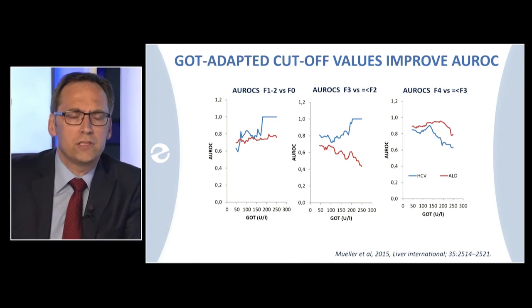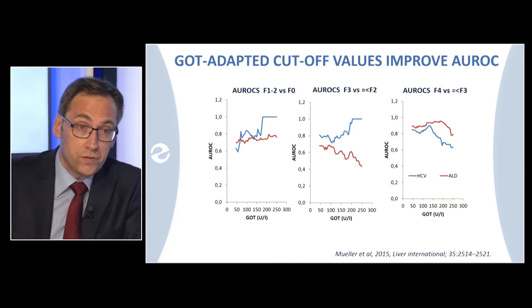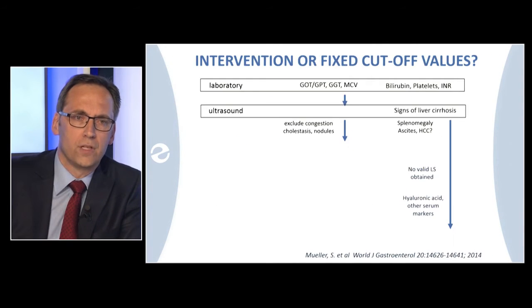I did not mention that we could also show in the study that, in fact, it improved fibrosis stage assessment. And what I show you here is the AUROC. And you may see, although it's quite busy, that indeed, if you apply this algorithm, you improve the AUROC, the diagnostic accuracy of the whole algorithm.